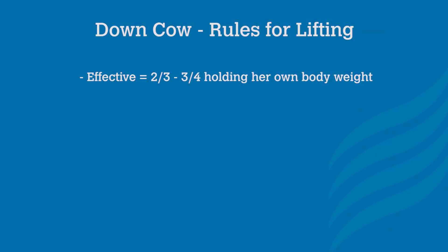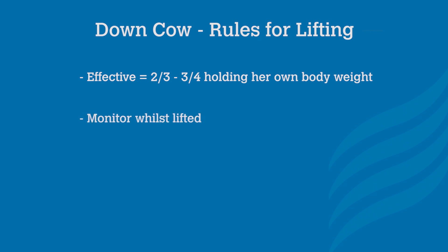If the cow is standing effectively — meaning she's taking about two-thirds to three-quarters of her own weight — continue the lift. But you must be able to monitor the cow so you can lower her as soon as she tires. This may occur in as little as a few minutes or as much as a few hours. It's important for the cow's welfare that she is not left hanging from a clamp.